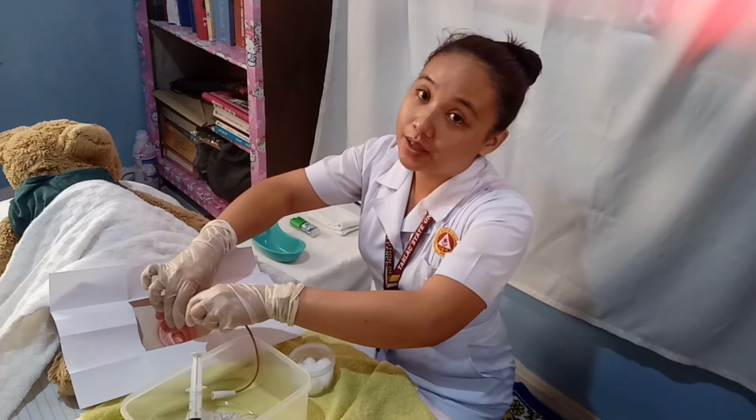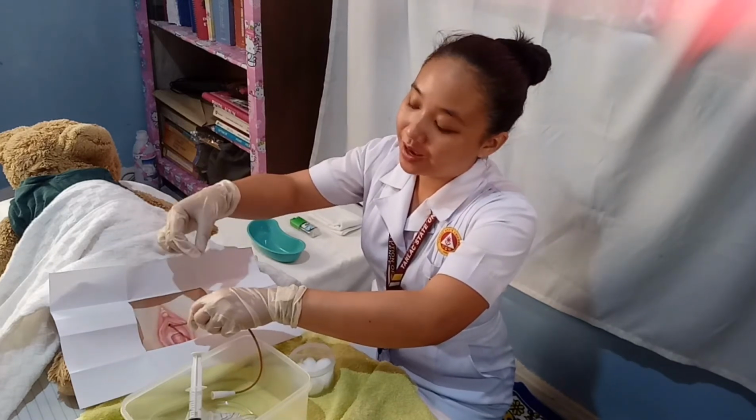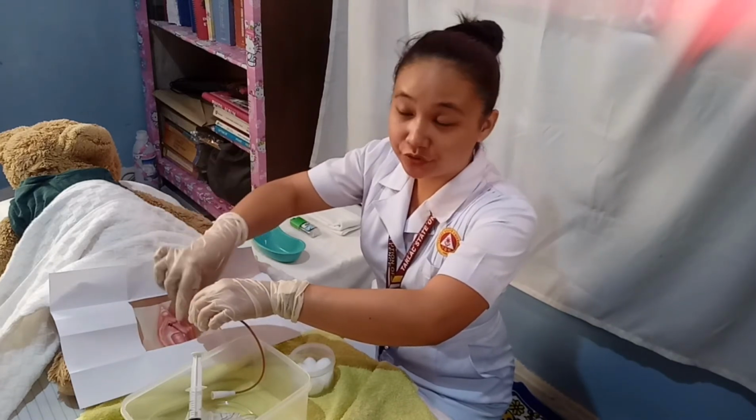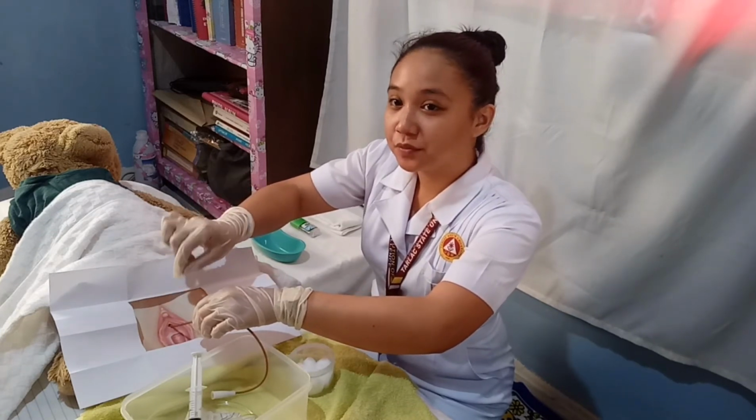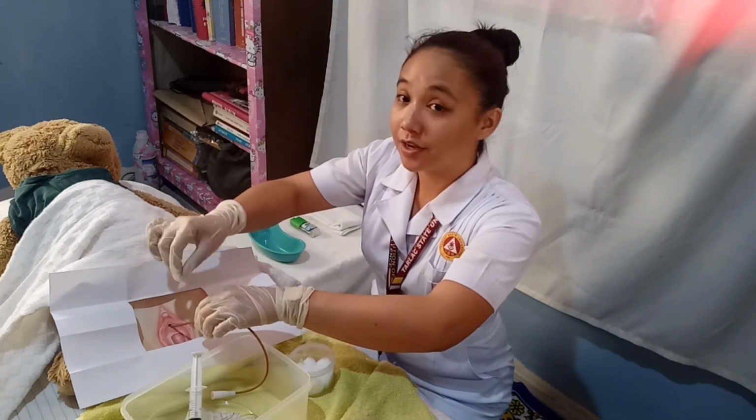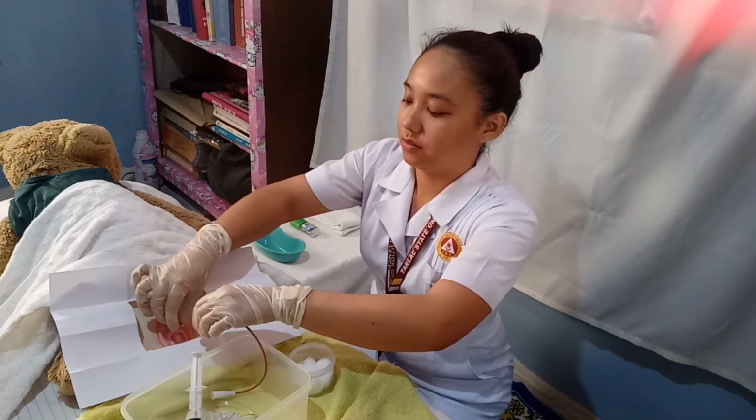So sir, ma'am, can you please breathe deeply? And for an indwelling catheter, you need to advance the catheter for about 2.5 to 5.0 centimeters or 1 to 2 inches.